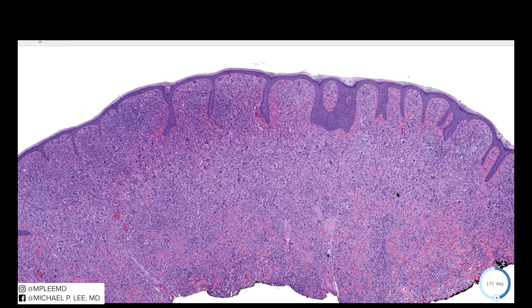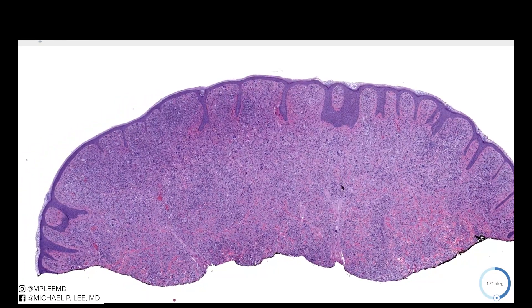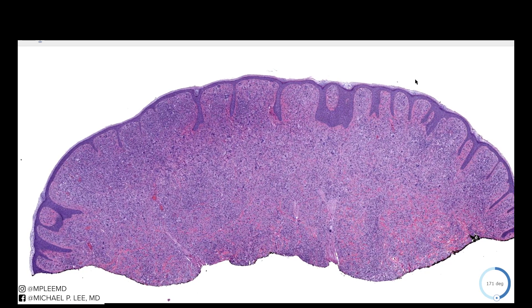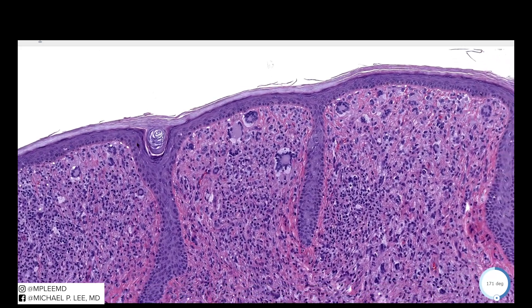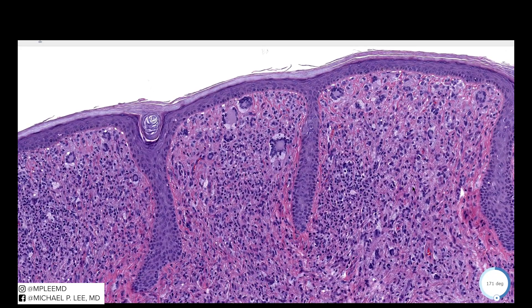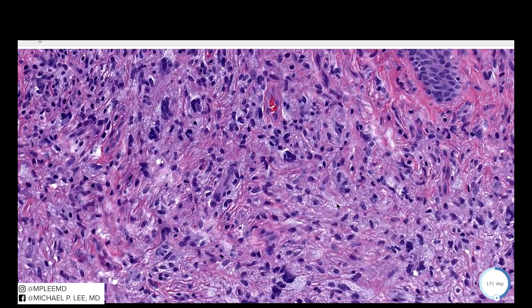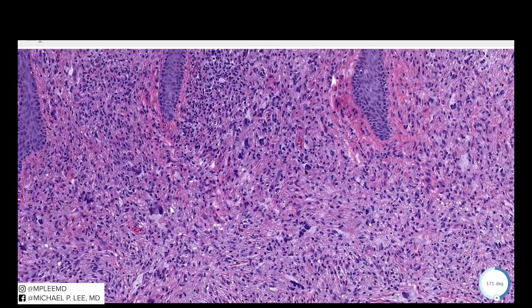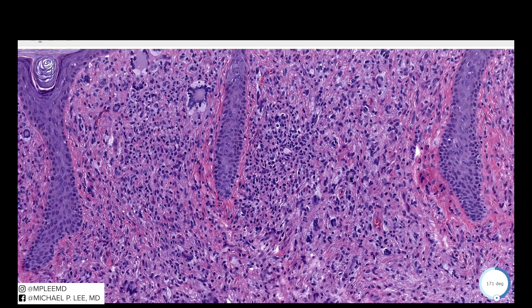To wrap up: this is a JXG, presenting as a nodule or papule depending on the size. It is a poorly circumscribed lesion with elongated rete ridges and a thin epidermis. The characteristic cell type for JXG is the Touton giant cell, but you will also see other types of histiocytes including epithelioid, scalloped, or spindled cells, as well as scattered lymphocytes and eosinophils.